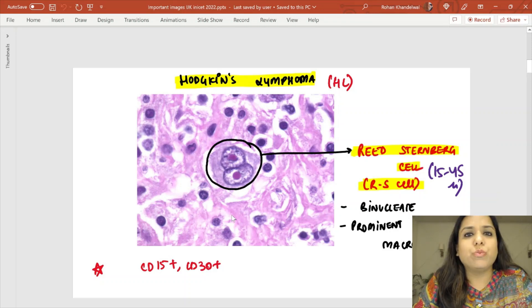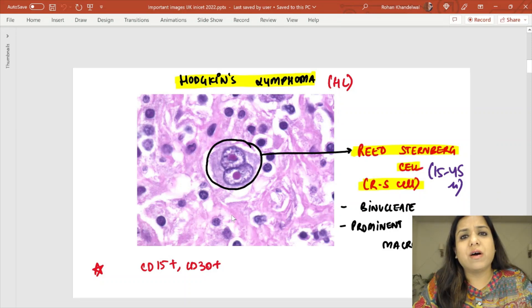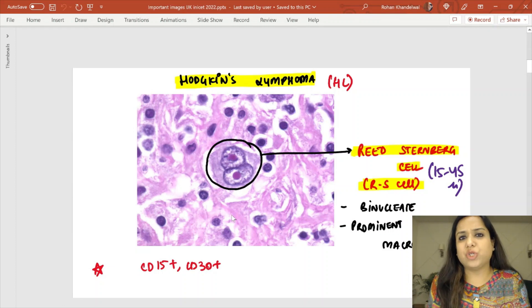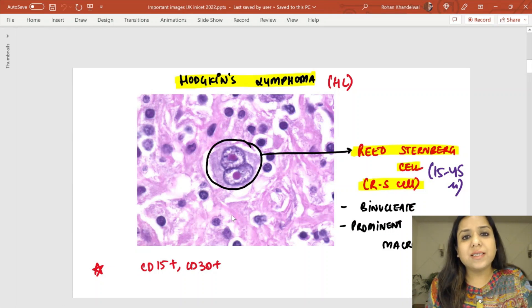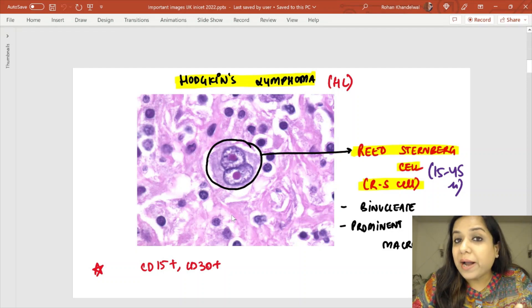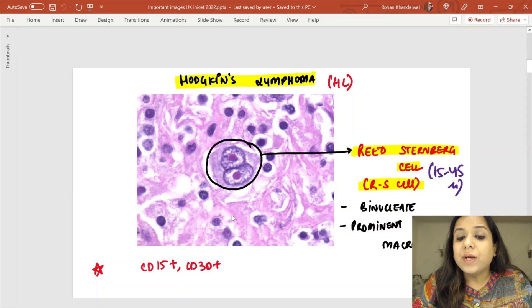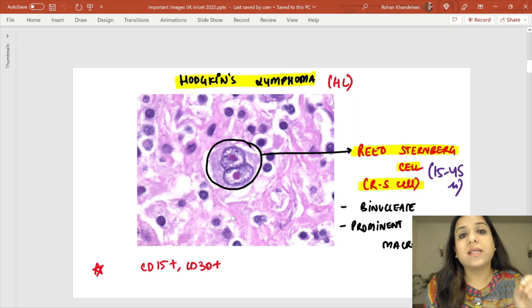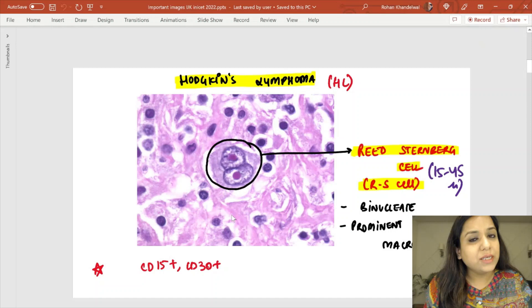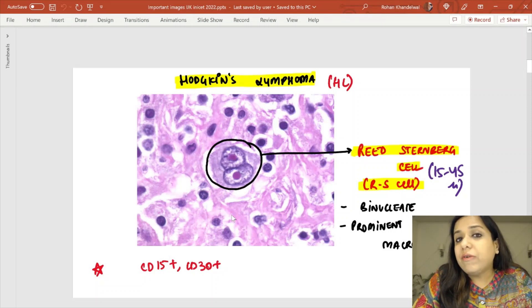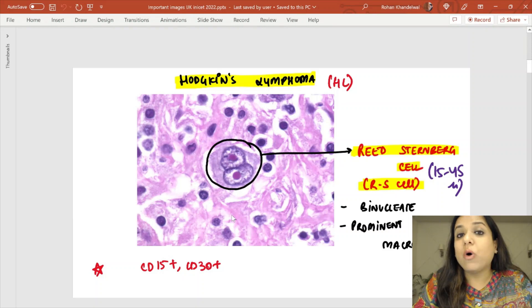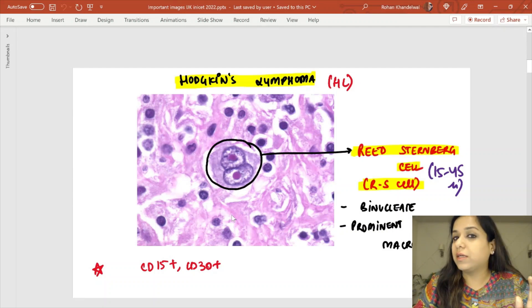This is one of the most important images asked in INICET, NEET, or FMGE exams. In the center is a binucleate large cell with prominent eosinophilic nucleoli — this is a Reed Sternberg cell or RS cell, seen in Hodgkin's lymphoma. The markers for Hodgkin's lymphoma or the Reed Sternberg cell are CD15 and CD30 positive.